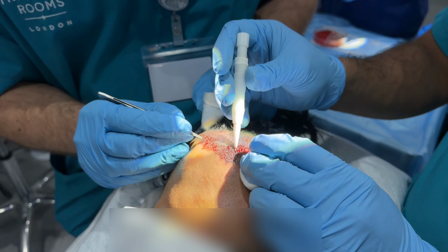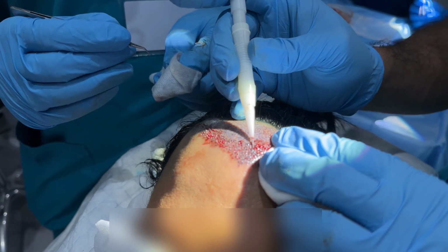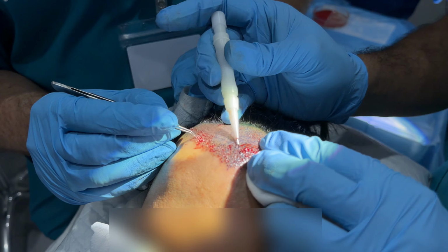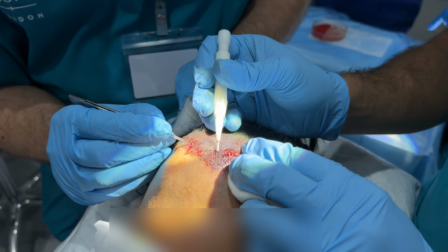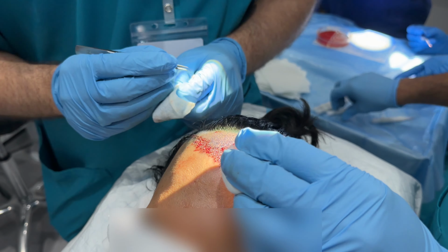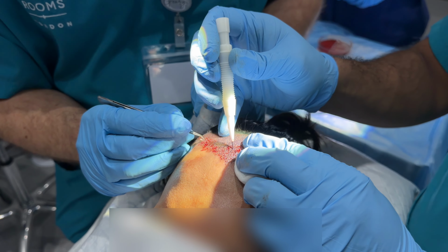Do you see how the one next to this has just started to make its way out a little bit here? And that needs to just be gardened back into there. That is the phenomenon of popping, and you do get that when the hairs are struggling to go back in. You have to either grab them and pop them back into the dish to be re-implanted, or sometimes you can garden them back in. But it actually makes the surgery a bit more technically challenging.